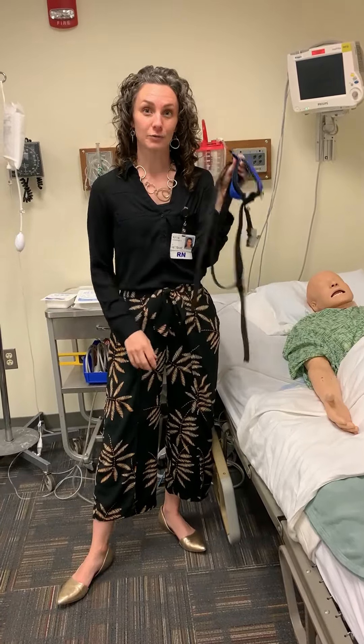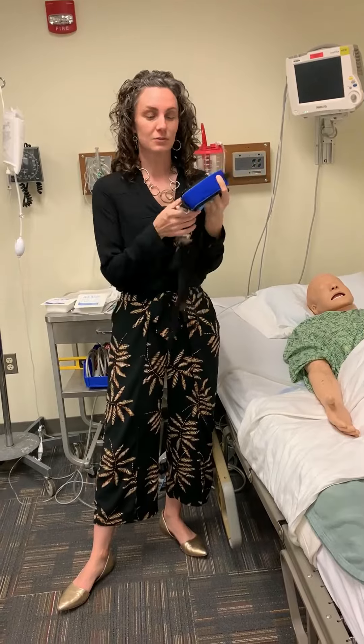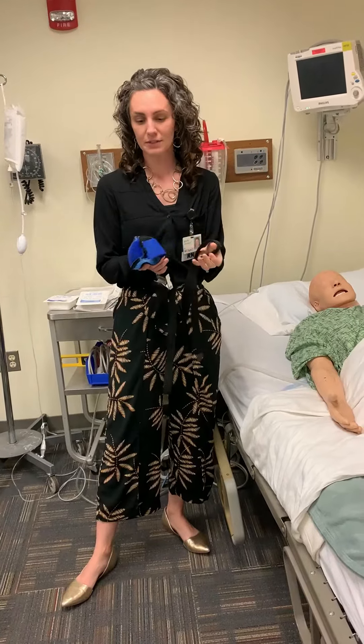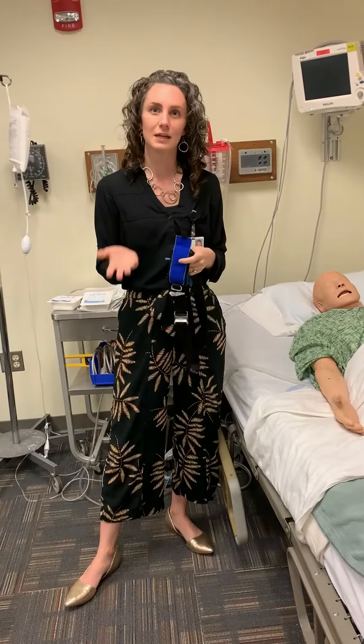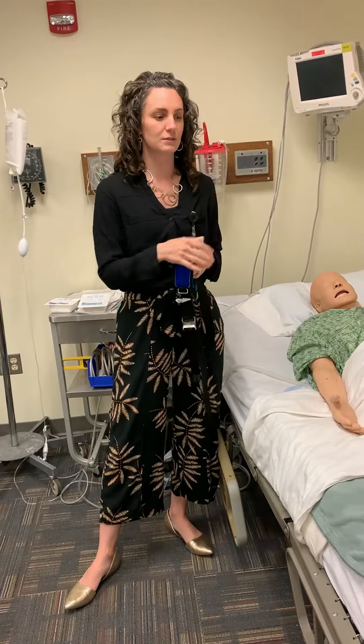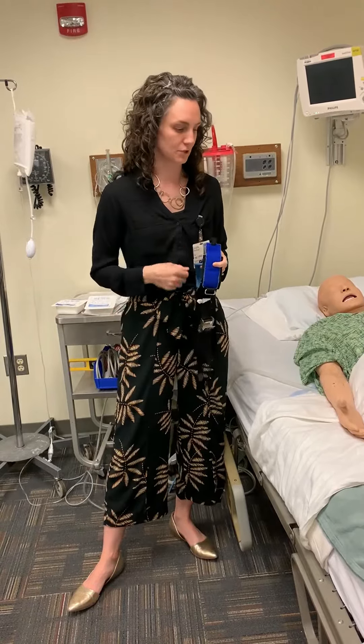Today we're going to look at how to apply a hard wrist strap. These also come in a bright red color. The only difference is that the red ones are a little bit longer than the blue ones, so a lot of times you'll see the red ones on the ankles. It really just depends on the size of the patient, so use what fits your patient.